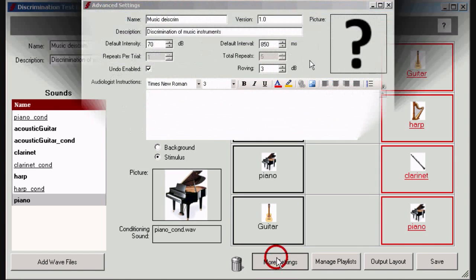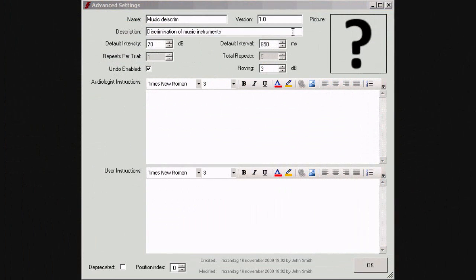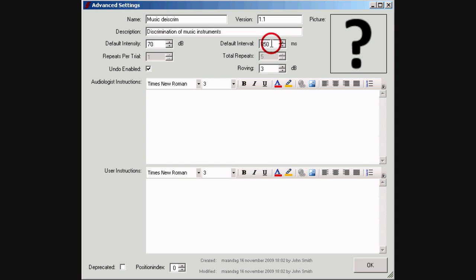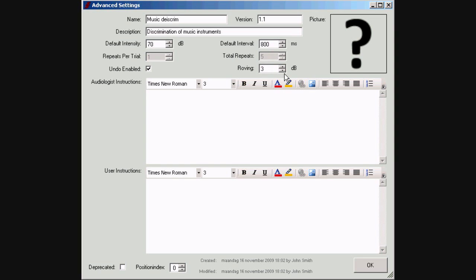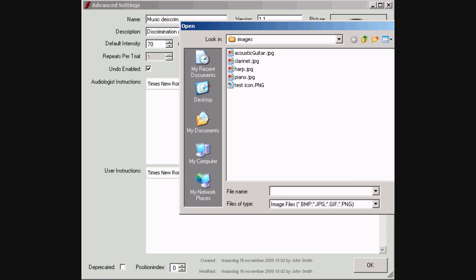More settings can be defined if wanted. You can attribute a test version to the test. You can change the default interval between two consecutive presentations. You can change the roving level. Sounds are presented at a level between the set intensity minus the roving level, and the set intensity plus the roving level. An icon can be added to represent the new test.